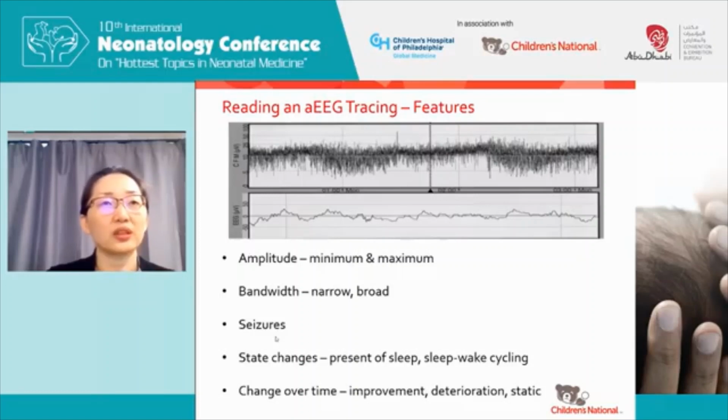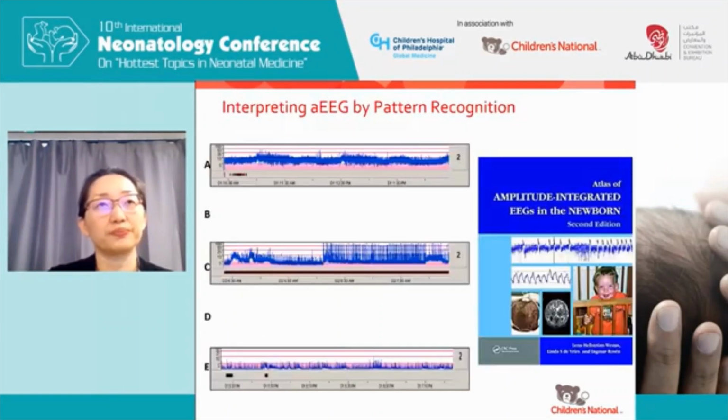And then I think one thing that was never really discussed a lot in all the studies looking at aEEG versus EEG is not about just picking out the seizures and abnormalities, but knowing what are artifacts or normal variants, and not over-treating that aEEG mistakenly.